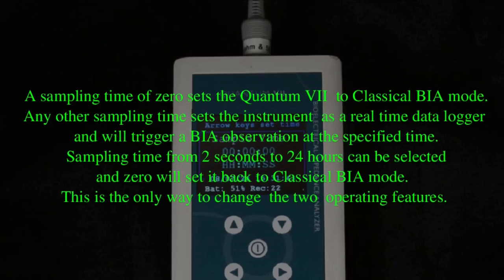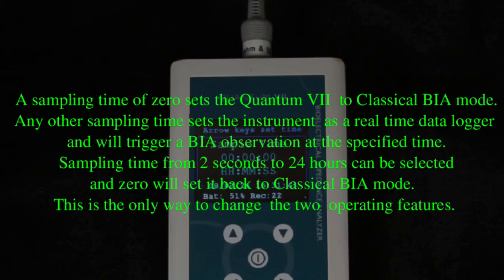A sampling time of 0 sets the Quantum VII to classical BIA mode. Any other sampling time sets the instrument as a real-time data logger and will trigger a BIA observation at the specified time. Sampling time from 2 seconds to 24 hours can be selected, and 0 will set it back to classical BIA mode. This is the only way to change the two operating features.